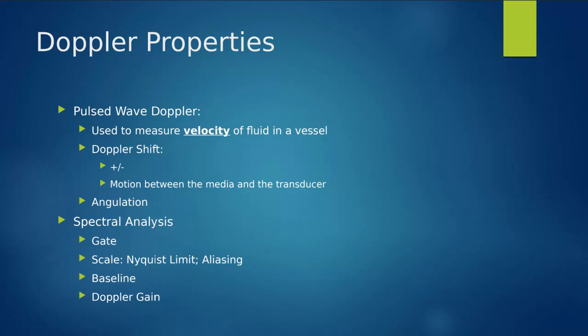So what does this mean? This means that our transducer is sending in a sound wave. It's reaching this reflection, right?